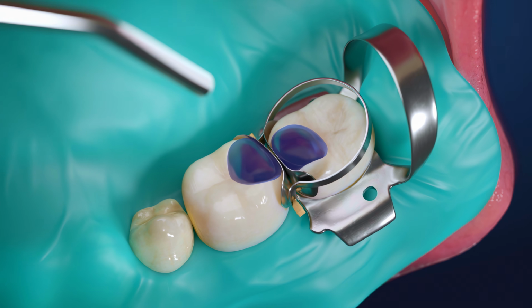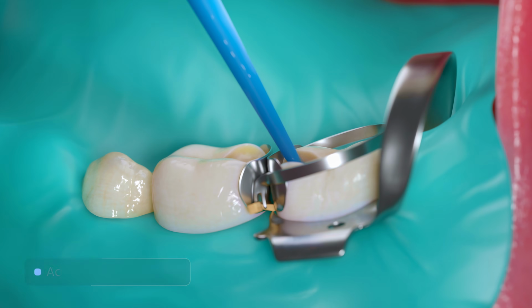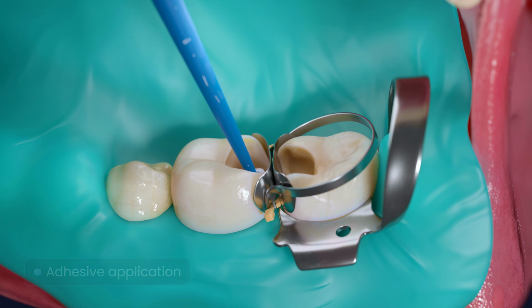Acid etching of the enamel and dentin is performed according to the adhesive system used. An adhesive is applied with a microbrush, air-dried, and light-cured.